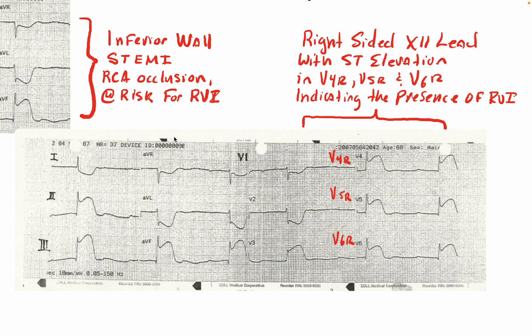You can see this is again accompanied by an inferior wall STEMI. But you could just as easily imagine that all the other leads were normal with nothing but depression in V1 and V2 — that alone, with signs and symptoms of an acute coronary syndrome, would still suggest the presence of an isolated posterior wall MI. This is a patient that needs to go immediately to the cath lab, even though they may not meet standard STEMI criteria. This still falls under the umbrella of an OMI — an occlusive myocardial infarction — or what we call a STEMI equivalent.